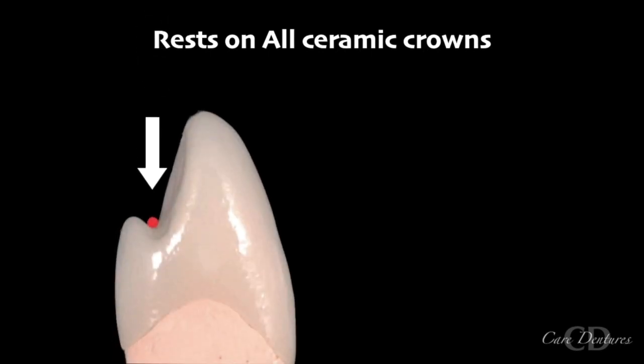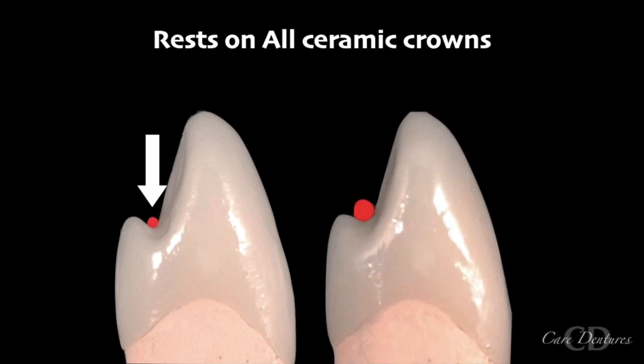After browsing through some literature, I came across possibilities of creating rest seats on surveyed all ceramic crowns. It is found that monolithic CAD-milled zirconia crowns can be used as rest seats for a cobalt chromium cast partial denture, provided the rest seats created are wider than normally followed and any sharp edges are completely avoided.